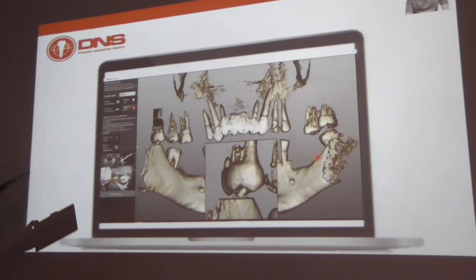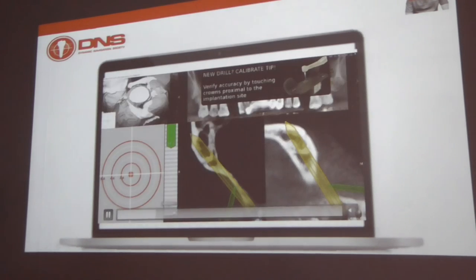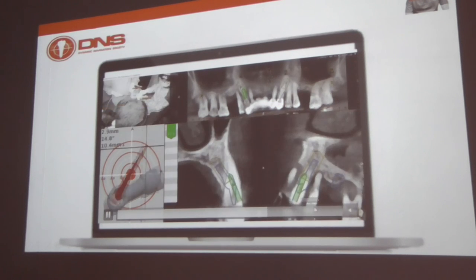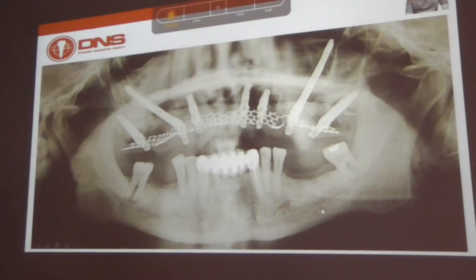This is a case where good teeth were present. I've used teeth rather than bone screws to trace, and then plan and place the pterygoids, routine, and the post-op radiograph.